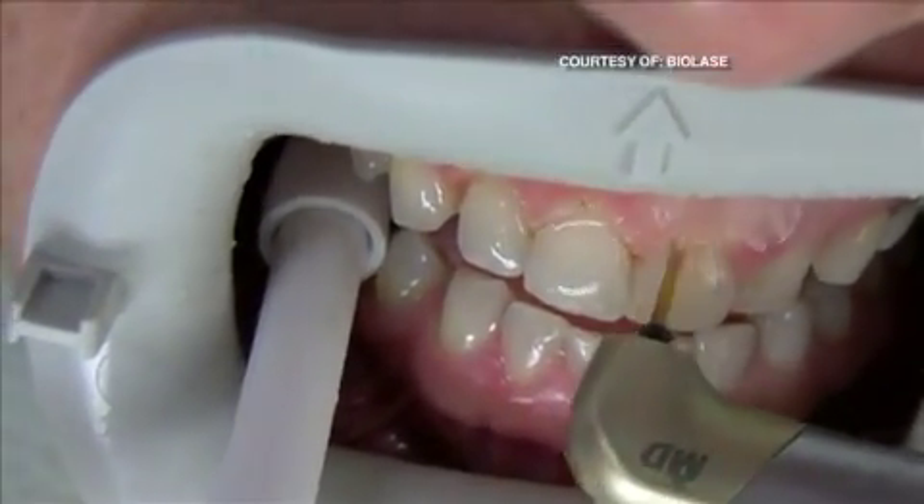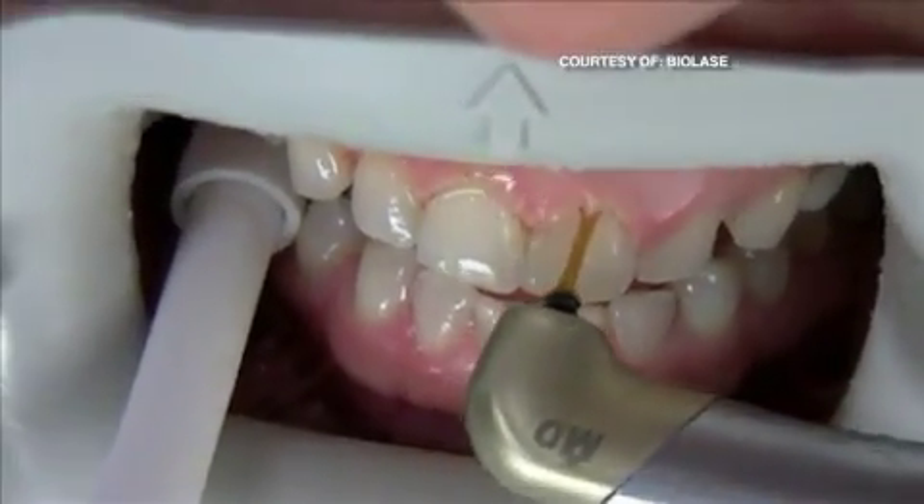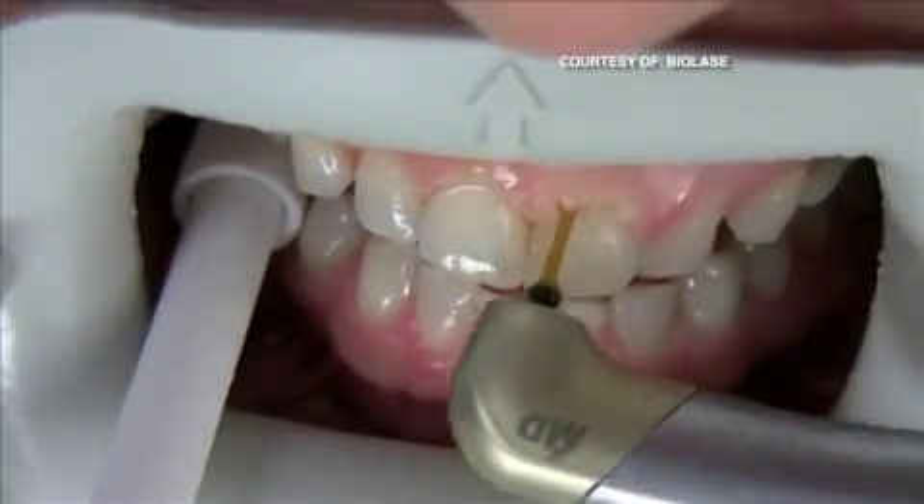Here, the laser is used to cut away a patient's gums. The tissue literally vaporizes with less bleeding, swelling, and damage to the surrounding area.